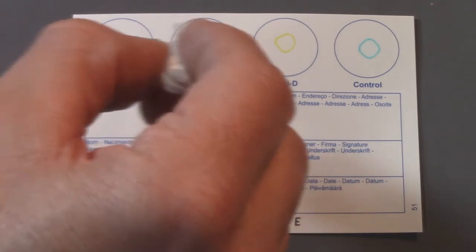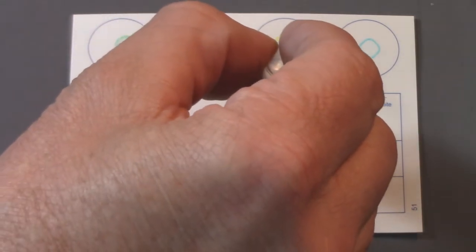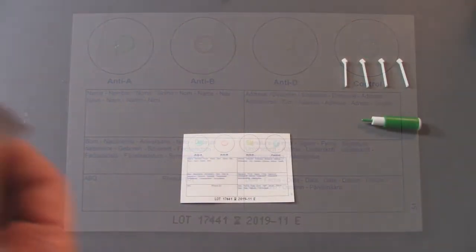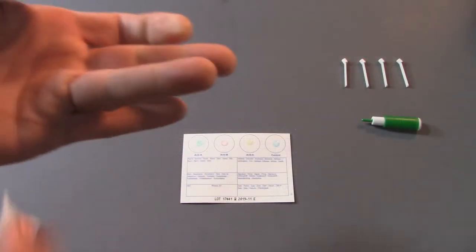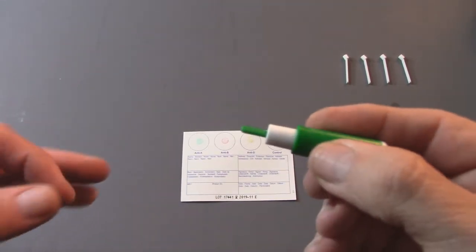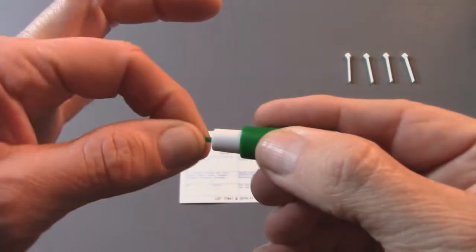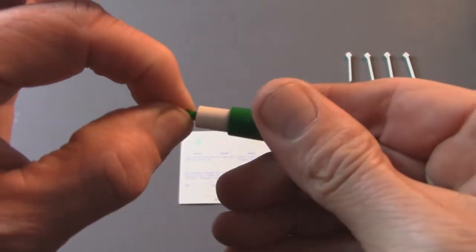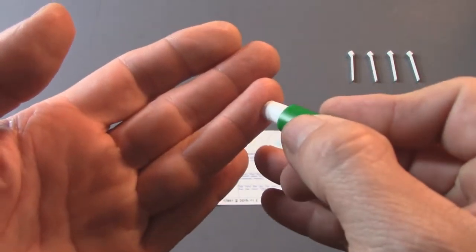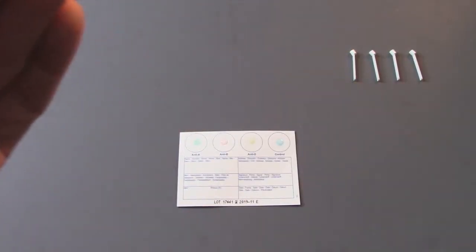Apply a small drop of water in each circle. Clean your finger with a sterile swab. Take the lancet and twist the colored tip. It may take a couple of attempts — but don't activate the lancet yet, as it can only be used once. I found that out and had to open the other package. Puncture the soft skin at the side of your fingertip by pushing the lancet firmly against the skin.